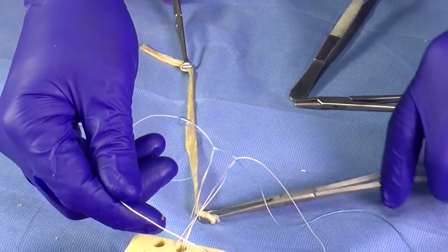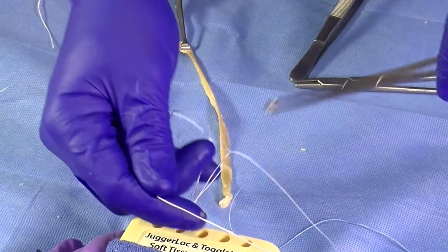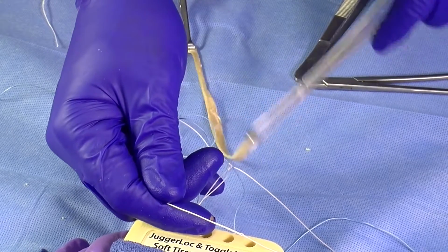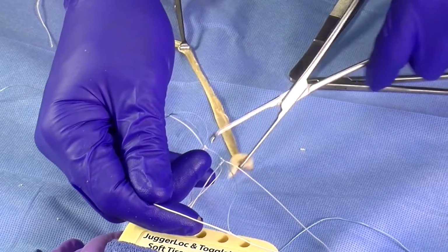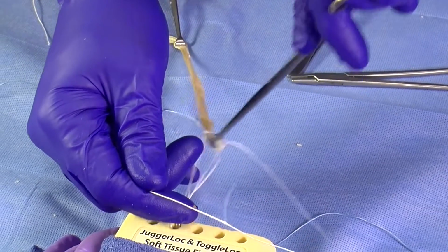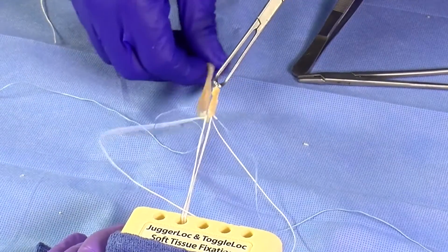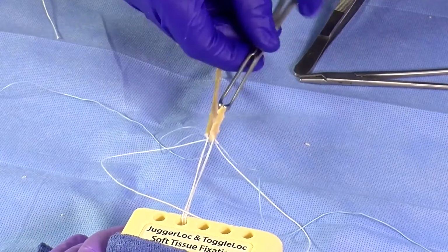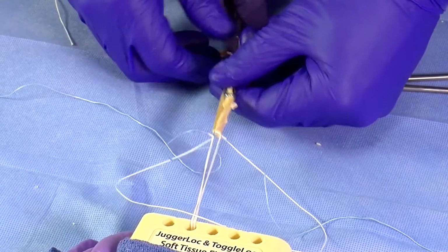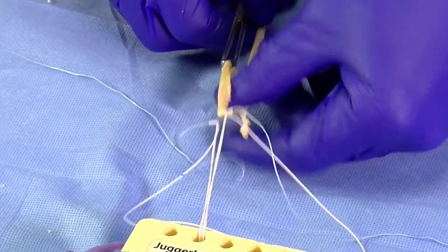On the 2/9 ToggleLoc without needles, that suture, that center loop is white, and I will have my tendon secured, and I usually have a right angle clamp attached to it. I will reach through this loop and pull it back on itself and give me just a little more slack. And then we're going to hold it like that, and you can even just hold those two together. And so this will be the long head biceps tendon coming out of the arm.